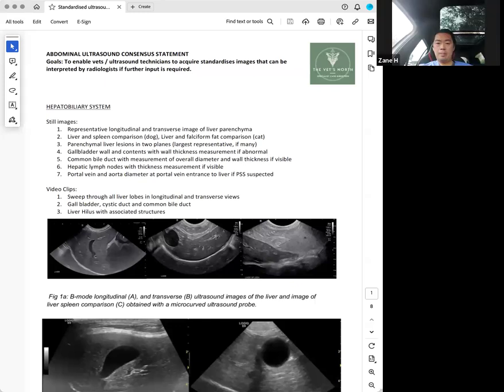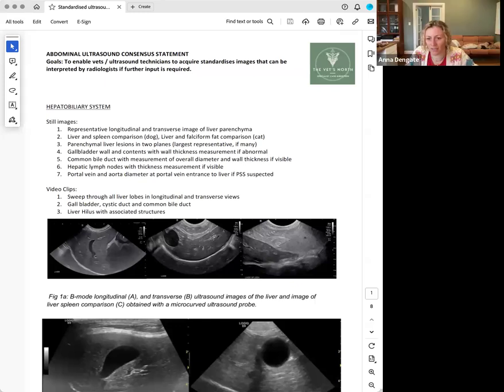Yeah. So the portal veins here are the ones with a bright wall, as opposed to the hepatic veins, which is this black line next door to that. They actually look quite different if you're assessing vasculature in the liver. Hepatic veins have not bright walls. Portal veins have very bright walls. And if they look really, really bright relative to the surrounding liver, then you can say the liver is probably a little bit hypoechoic.